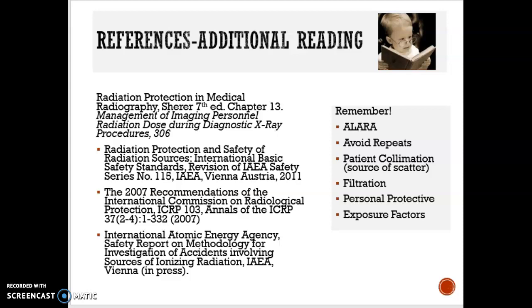Wear the lead apron and the thyroid collar and the lead glasses when you're working in the fluoroscopy or interventional or operating room. And try and manipulate those exposure factors when you are in the X-ray room to optimize not only your image, but also to optimize the exposure so that you're not getting any excess scatter radiation and increasing your dose.